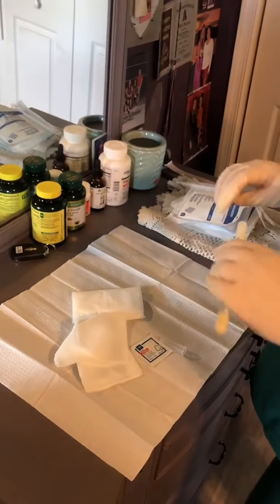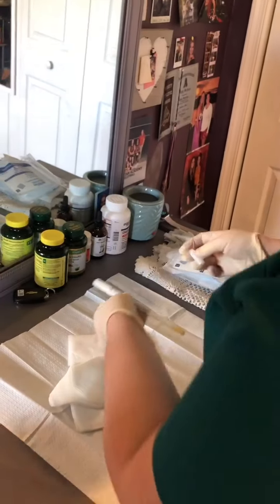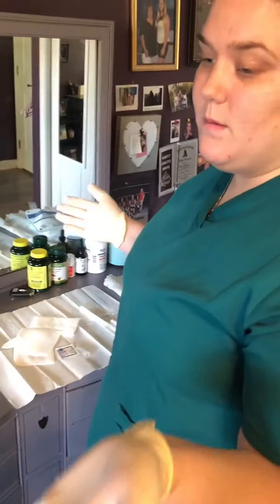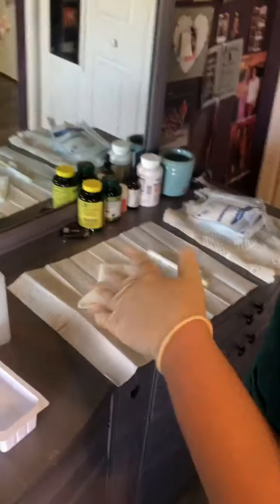So then after I did this, I would label it. So this is still sterile. I would label it with the location, so the abdomen, the date, time, and my initials, and then I would send that down to the lab with the requisition form labeled with the same things. So now that I have obtained my culture, I'm going to redress the wound.